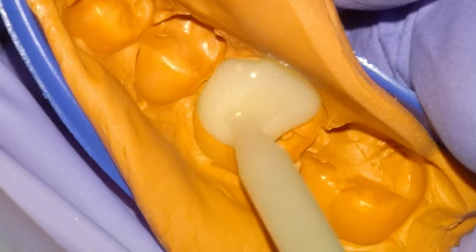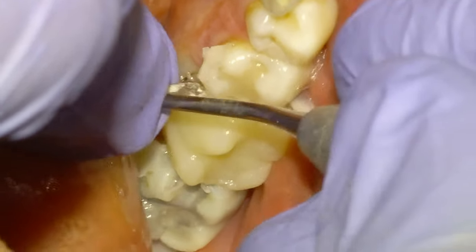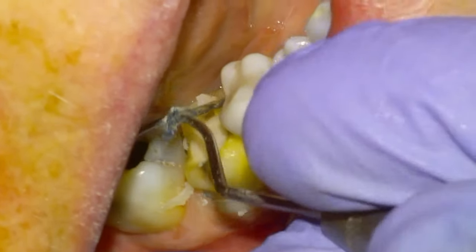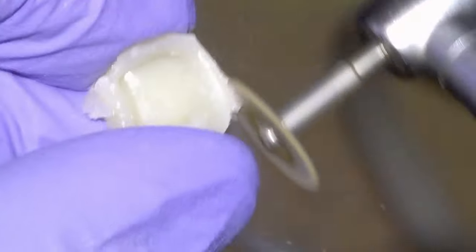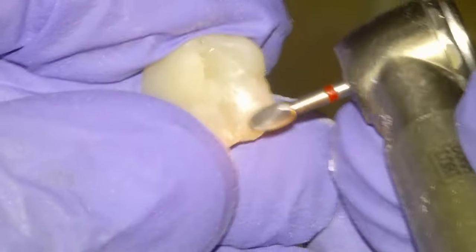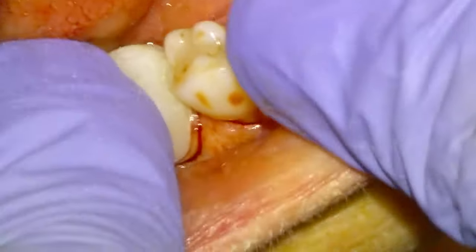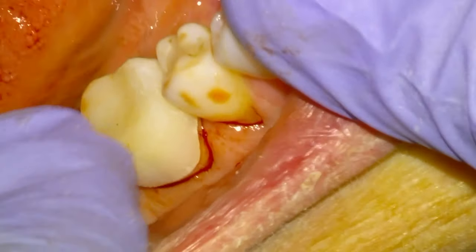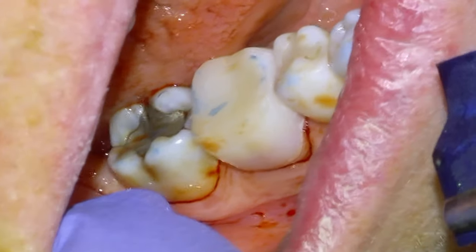We'll show the scan later on, but we'll make the temporary now. Using the template and seating the tray that we took before, give it a minute, flick it off with a spoon, remove the cord and the excess temp material, and then adjust the margins of the temporary with a wheel. Then I'm going to take a millimeter of material off the occlusal surface right off the bat because we don't want the temp in occlusion. We'll mark with bite paper and take down any blue spots.